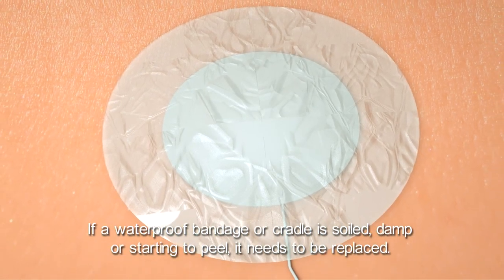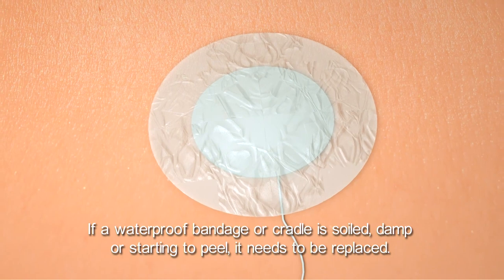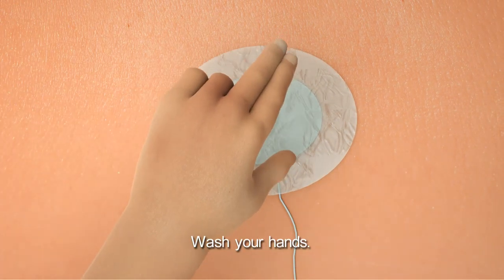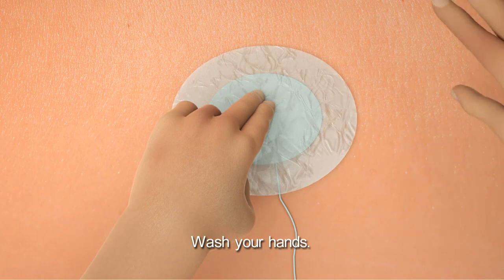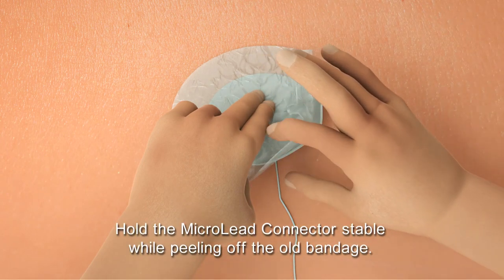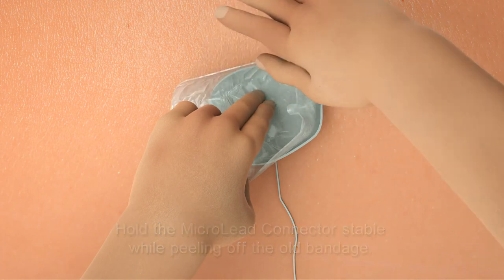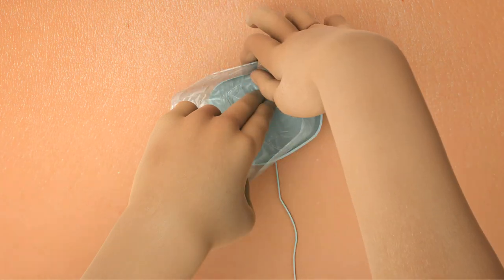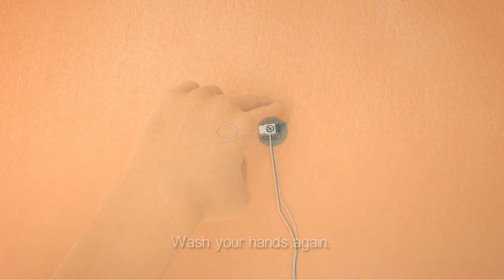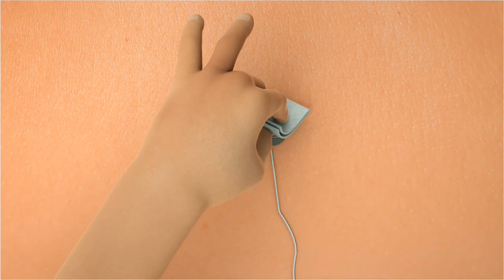If a waterproof bandage or cradle is soiled, damp, or starting to peel, it needs to be replaced. Always wash your hands prior to changing a waterproof bandage or cradle. Hold the MicroLead connector stable while peeling off the old bandage from the edges. Wash your hands again and lightly clean around the area of the bandage, cradle, and exit site.